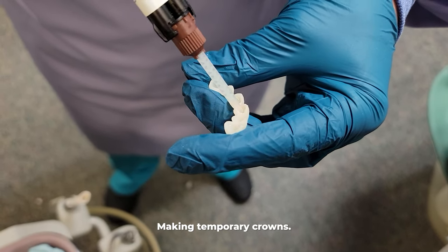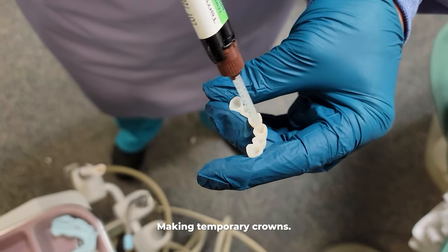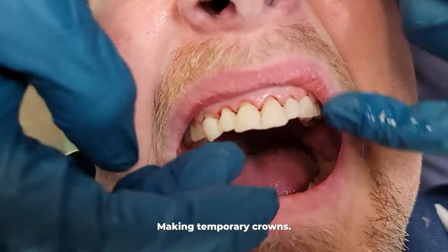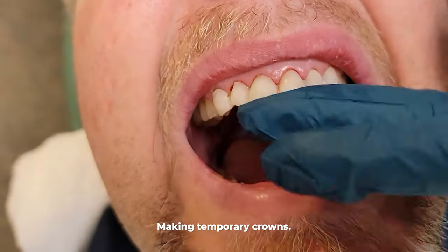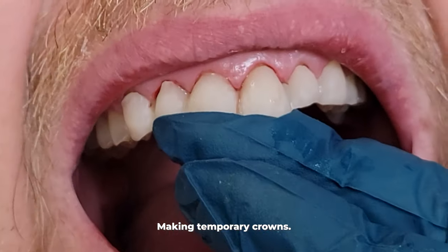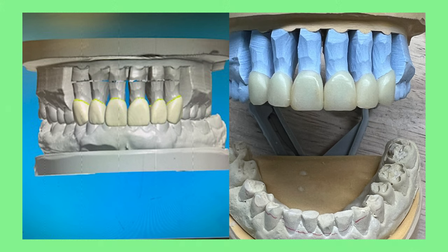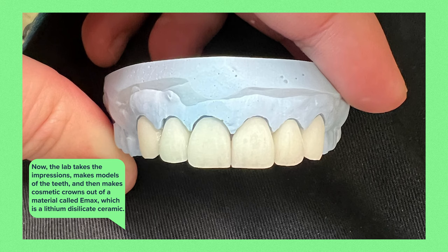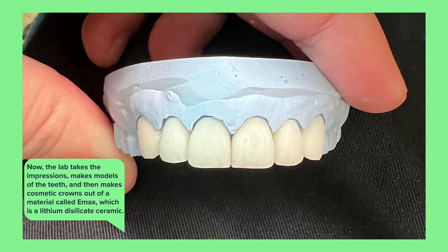We do this all as kind of one unit. These temporary crowns are what the patient is going to use for a few weeks until we get those final crowns back. The lab takes those impressions and the shade and makes models of the teeth, then in this case they're going to make cosmetic crowns out of a material called Emax, which is a lithium disilicate ceramic.